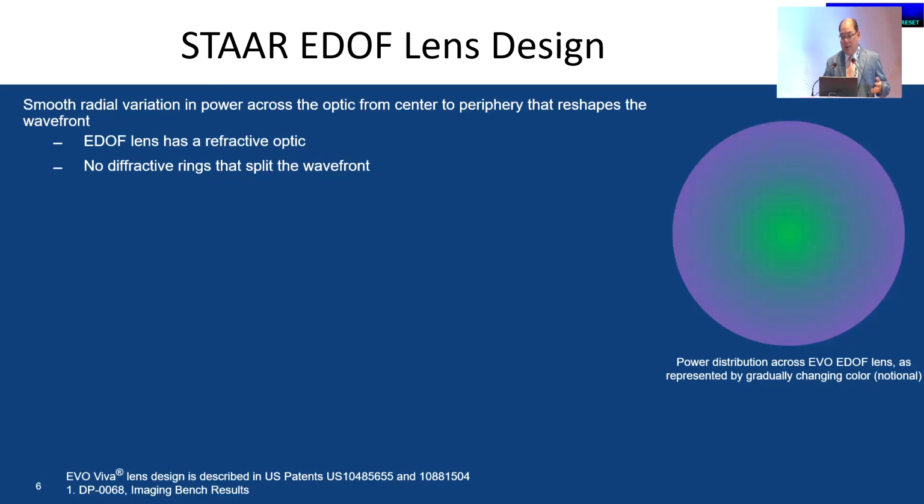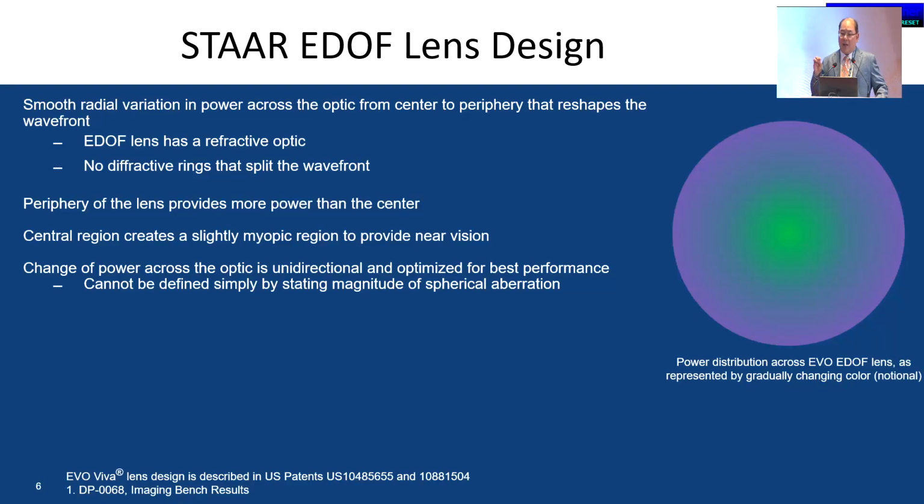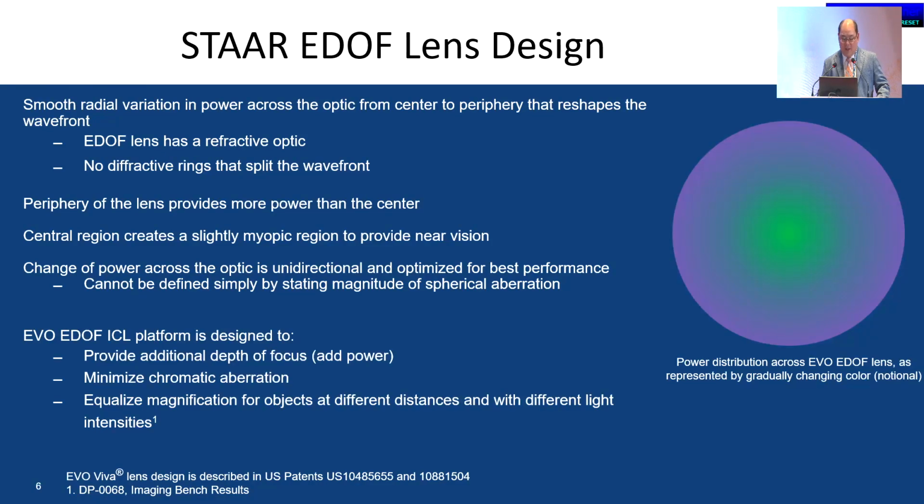So the EDOF ICL is this refractive design. It is not a multifocal ICL, but a refractive change from the center to the periphery. The center has this add power, which gives you around a diopter of near add, and it's unidirectional, so from center outwards. It provides an additional depth of focus.